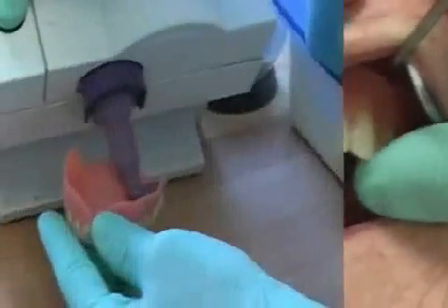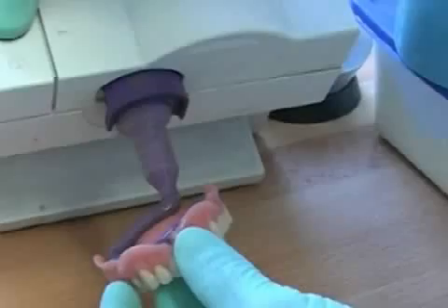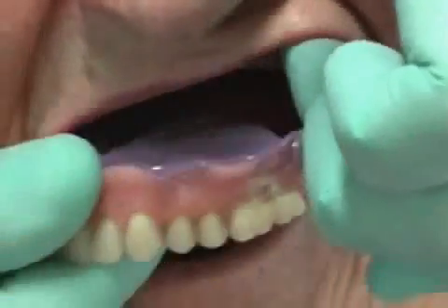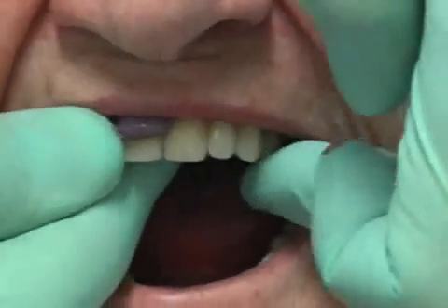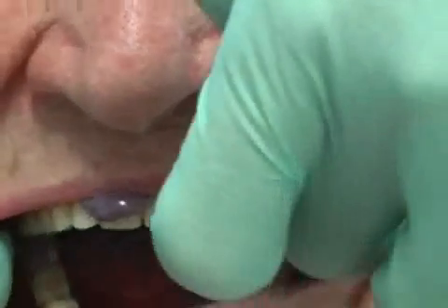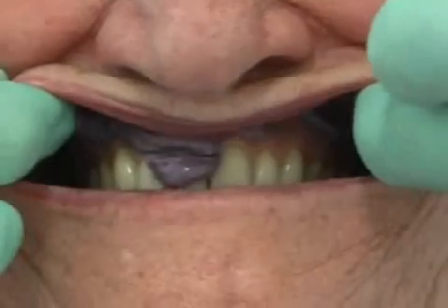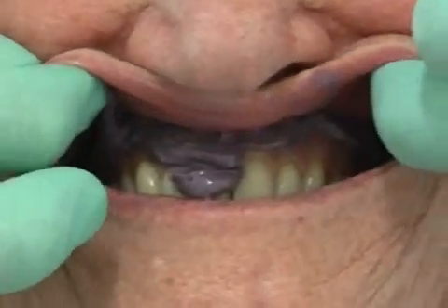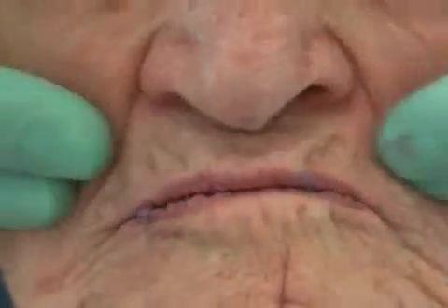First, impression material is applied onto the base of the prosthesis — it's the violet compound. While the compound is hardening, the dentist keeps pulling on the patient's lips. Furthermore, the patient uses his mimic musculature, swallows, and moves his tongue. This is all done purposely so that the dental technician can clearly recognize the borders of important anatomical structures, for example the tongue and the labial frenula, in relation to the impression.